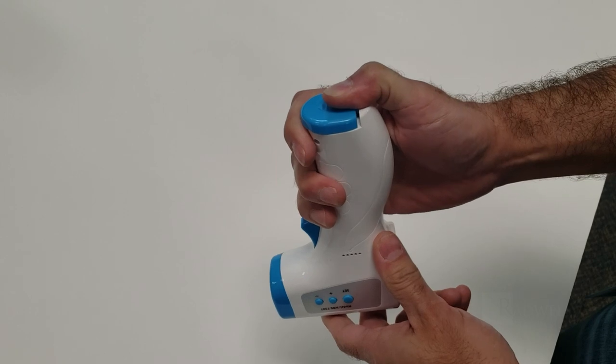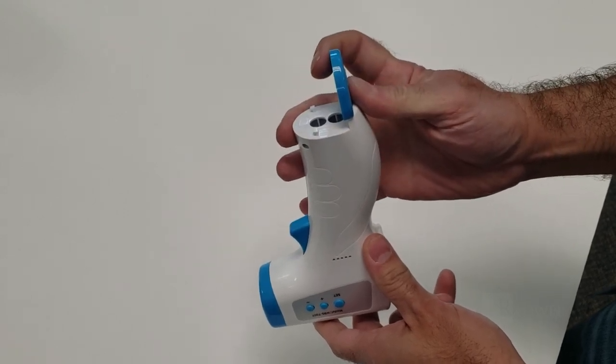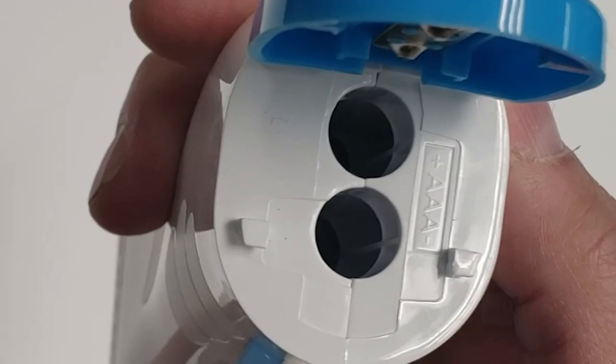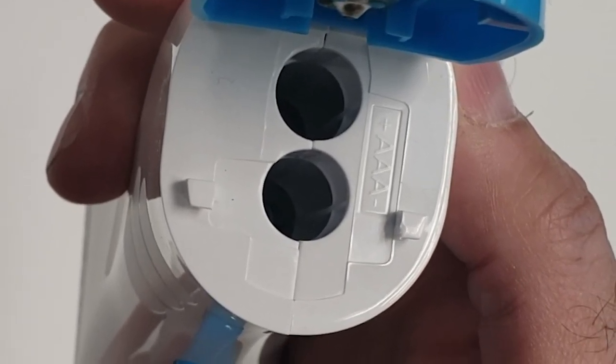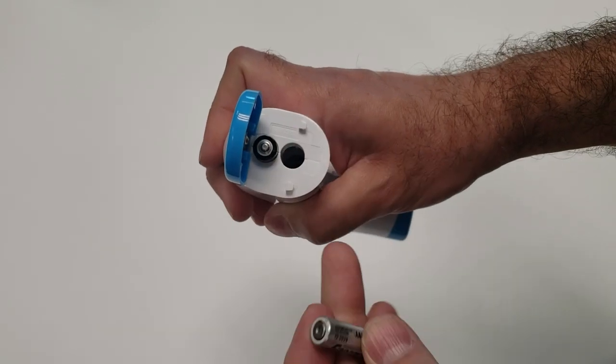Let's start with batteries. To insert batteries into the thermometer, open the battery door. You will see the positive and negative symbols to show how batteries should be inserted. This device uses AAA batteries.